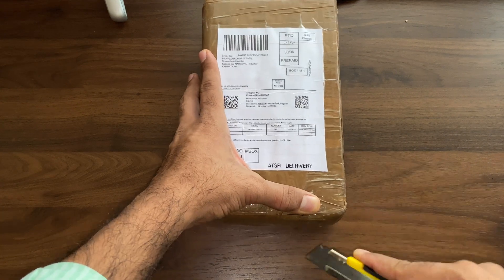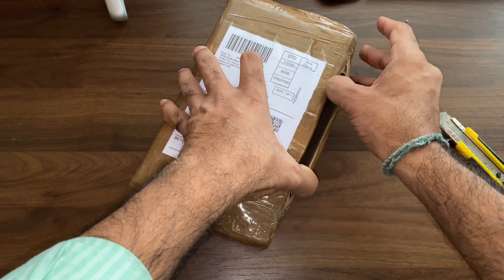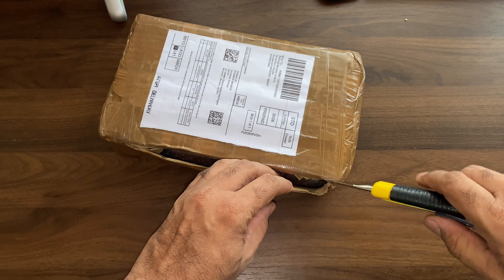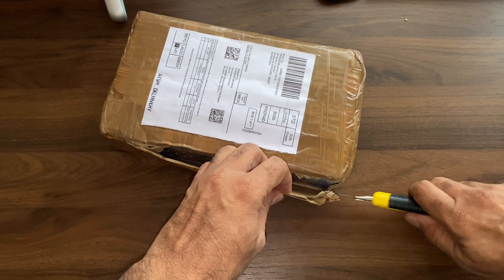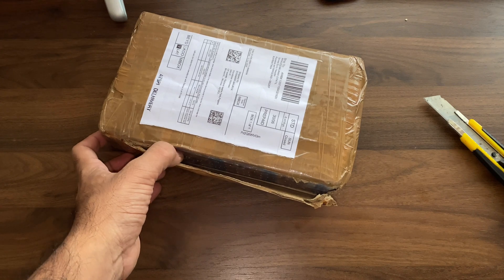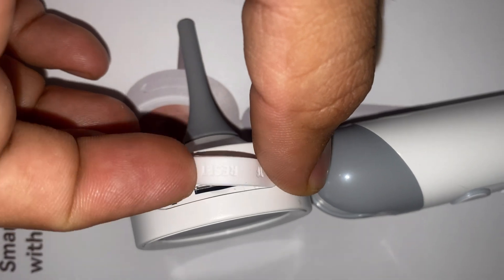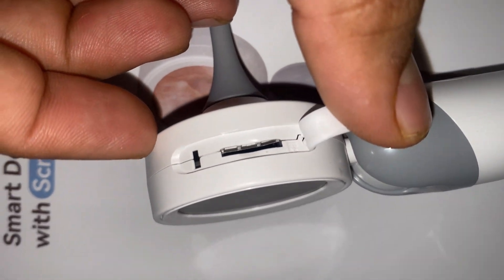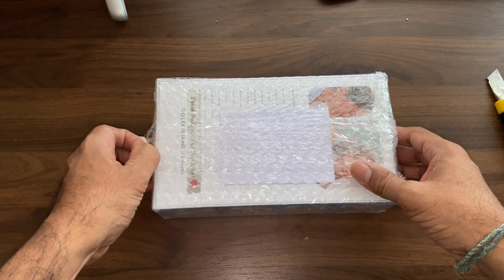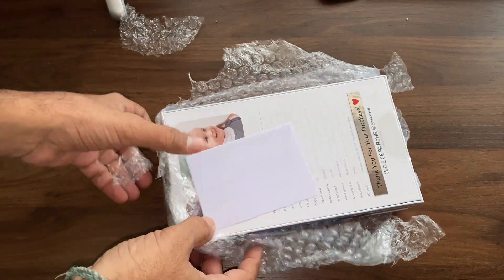By using this instrument we can picturize the lesions and examinations. It has three modes: an observation mode where we can directly observe, a record mode, and a memory card mode — it has a slot for a 128 GB micro SD card. We can also attach this device to a computer to observe stored images.